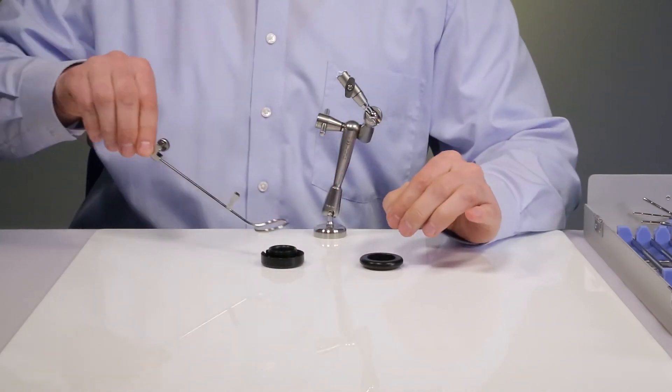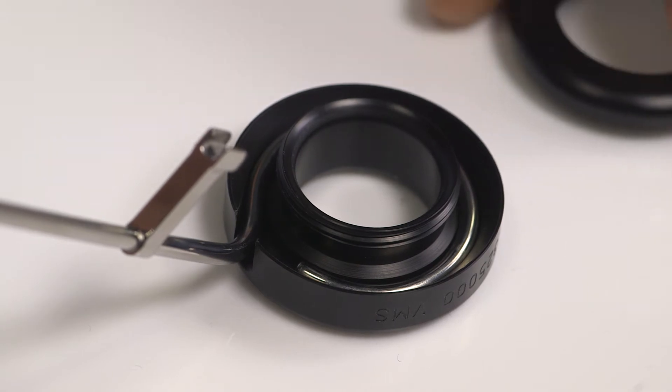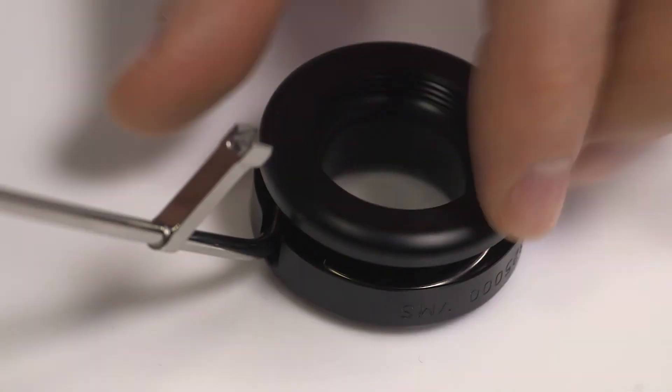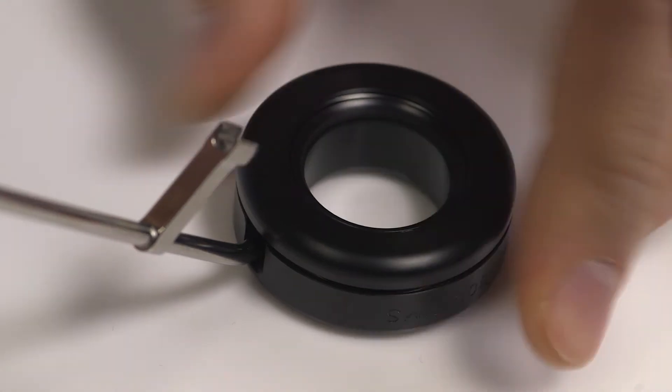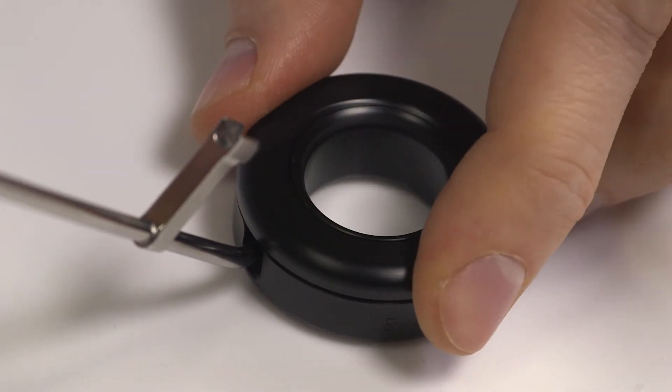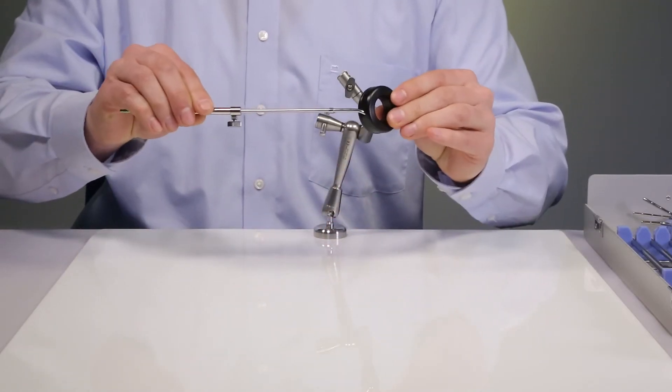The ring is put inside the distal part of the buildup cap and the proximal part is screwed onto the distal part. Now the assembly of the ring is complete.